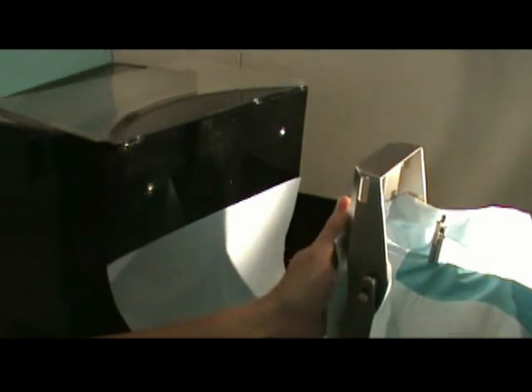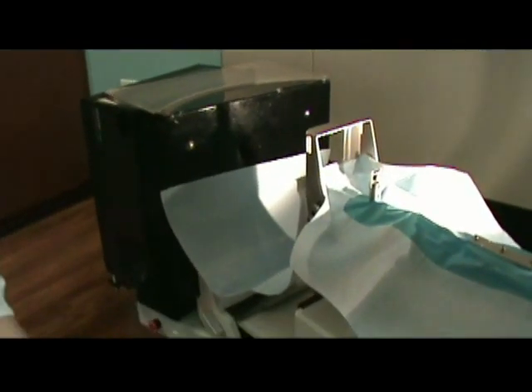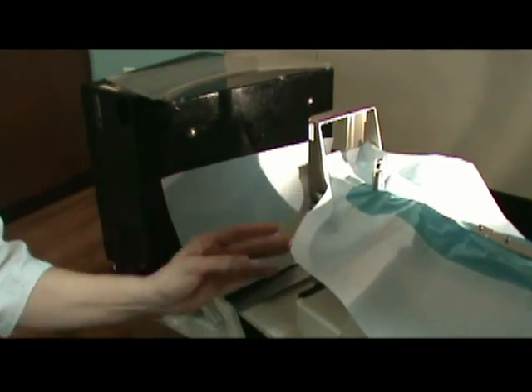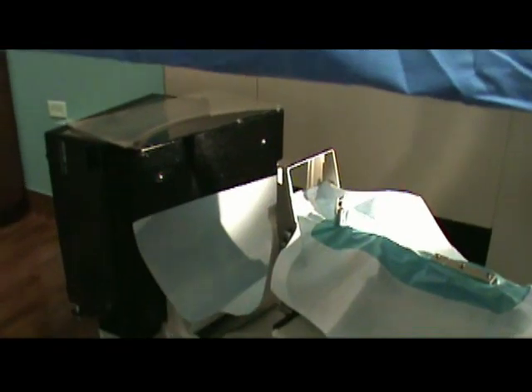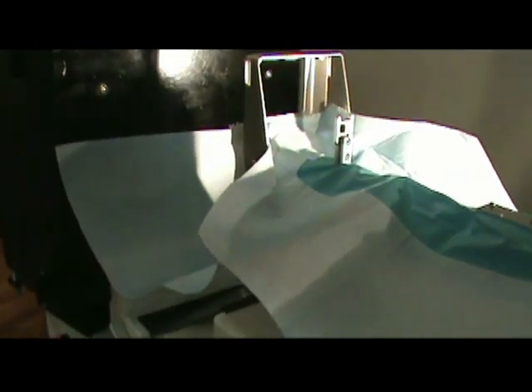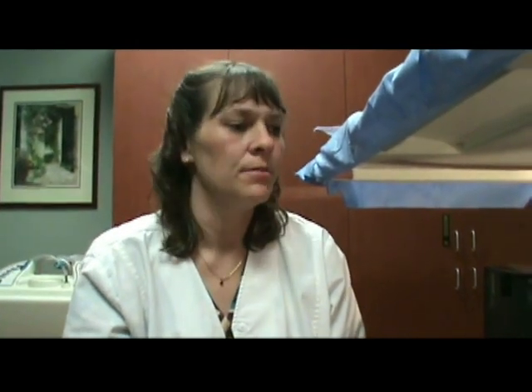The beauty of this is that it conforms to any older multi-care LORAD systems that don't have a hole in the paddle — some of them are solid. This makes it so they can utilize a draping system, and it's also just easier for people in general. This drape has a lot of flexibility.